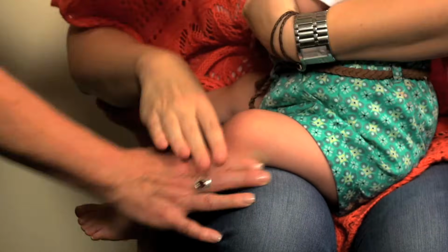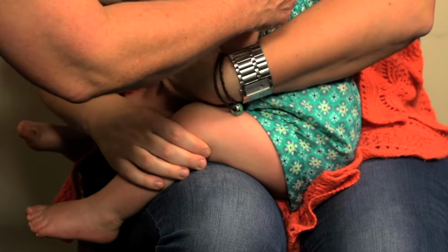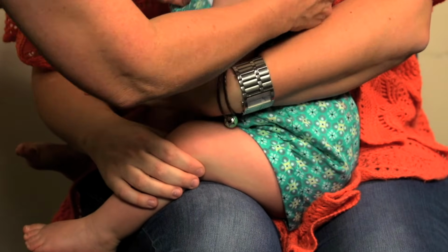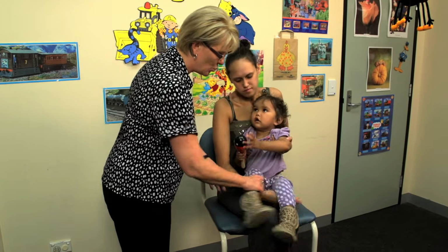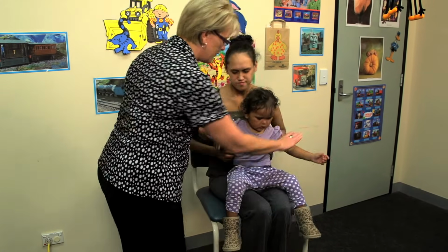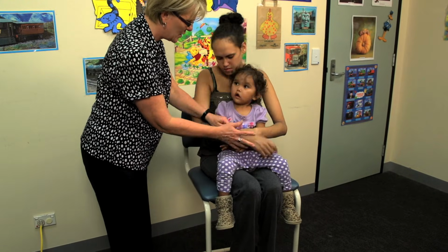Although this is the ideal position, it is more difficult for a parent to restrain the child and can often be a challenge for both the parent and the nurse. An alternative position, as demonstrated with this 18-month-old child, is to position the child facing away from the carer, with the child's legs straddled over the carer's lap.